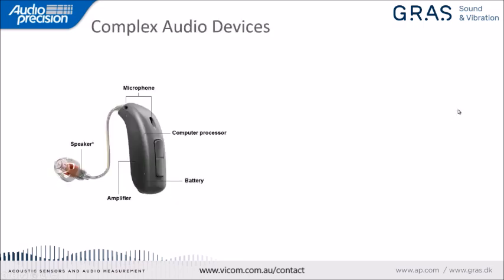All right, so a little bit about hearing aids. These are marvelous little devices from an audio test perspective. They are both acoustic input and acoustic output, which is kind of unique from an audio test point of view. But they're also quite complex devices. They typically have a couple of microphones, or at least one, but quite often more than one. They have a power amplifier, a little loudspeaker called a receiver in the hearing aid industry, also called a receiver in telephony applications. They have a computer processor for digital signal processing. They're battery powered and have some controls, and they are in a tiny little package, really.